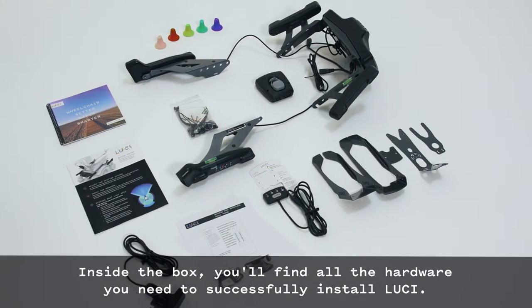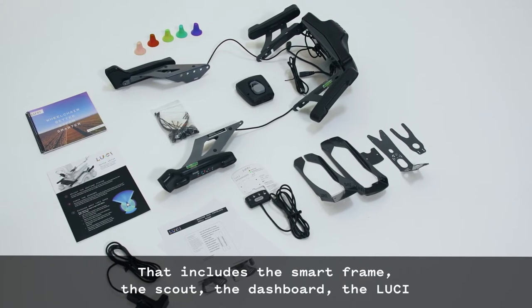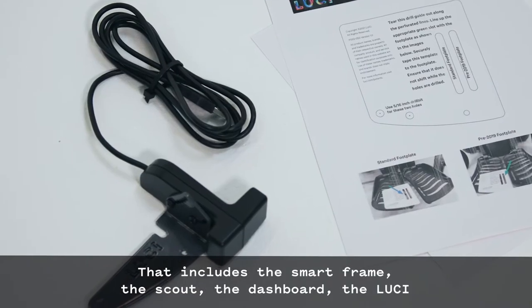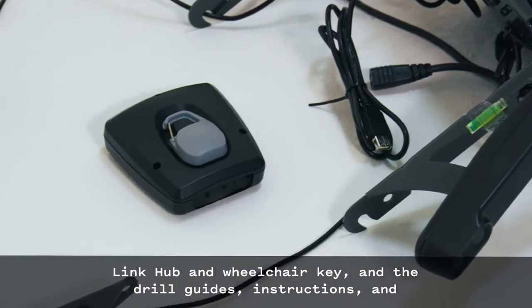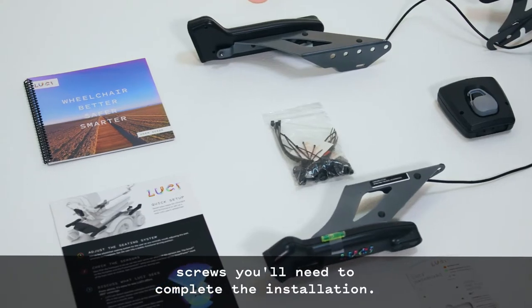Inside the box, you'll find all the hardware you need to successfully install Lucy. That includes the smart frame, the scout, the dashboard, the LucyLink hub and wheelchair key, and the drill guide's instructions and screws you'll need to complete the installation.